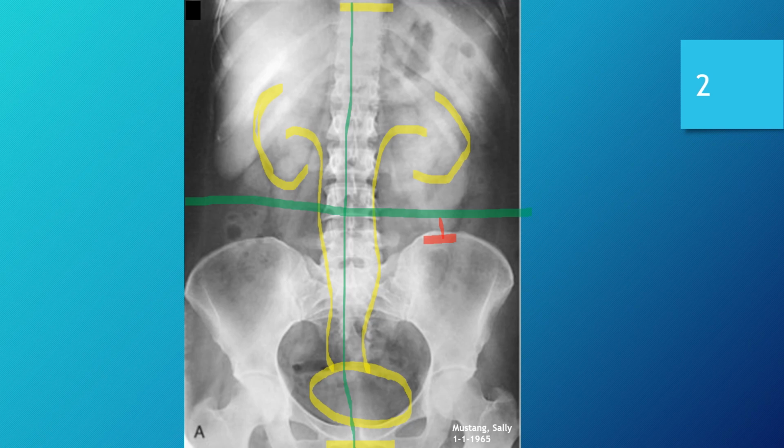Moving on, does the image demonstrate adequate exposure properties? The contrast for this image is very good. It's very, very good. We're able to see all of those margins for our soft tissue organs. We already covered the kidneys. We have even a bit of the liver margin right here on this side, in this area, is what we see right there.